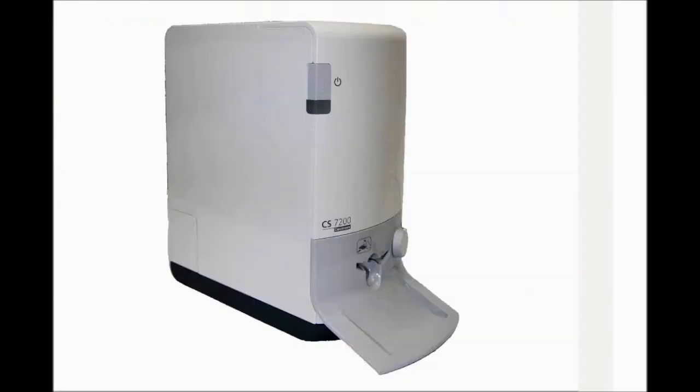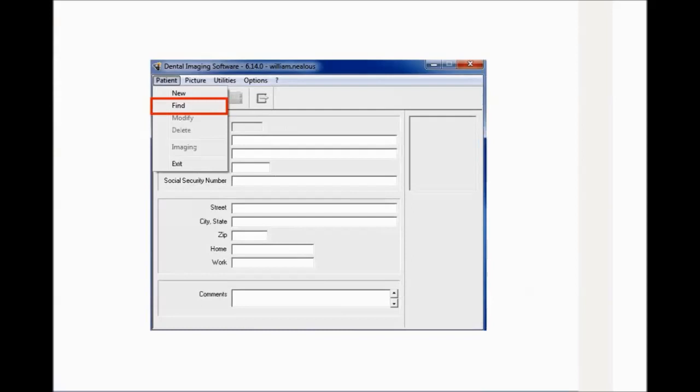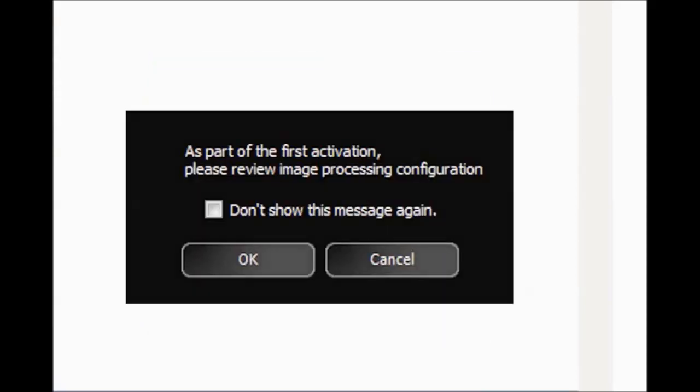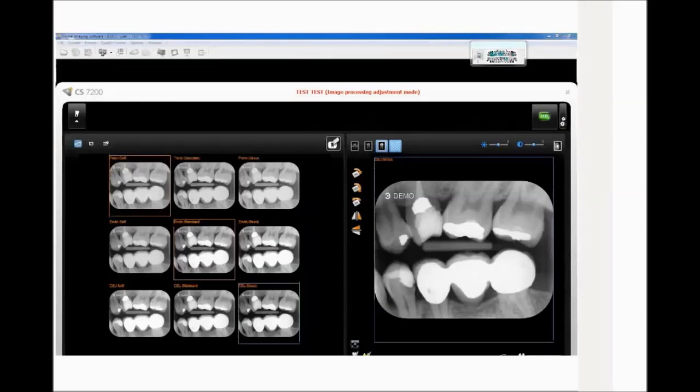Adjustment Mode. After installation is complete, image adjustment is required. To adjust the image enhancement, follow these steps: Launch Dental Imaging Software. Select or create a patient. The following dialog box is displayed — click OK. The Select Default Parameters window is displayed — click OK. The Image Processing Adjustment Mode window is displayed. Acquire an X-ray image and load the plate into the scanner. The scan image is displayed.